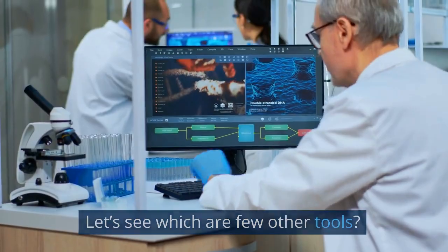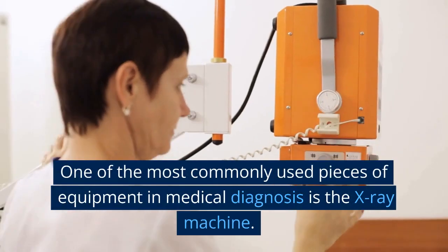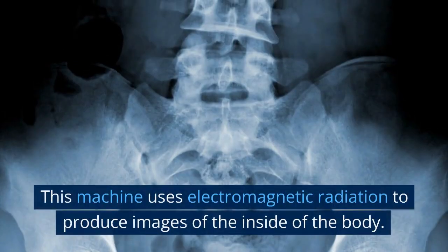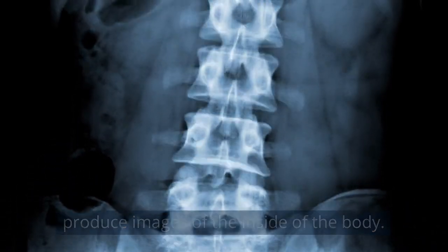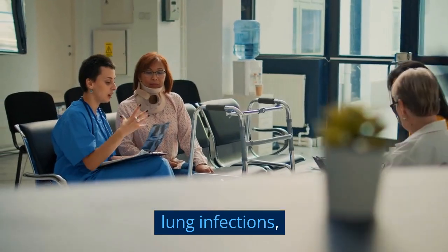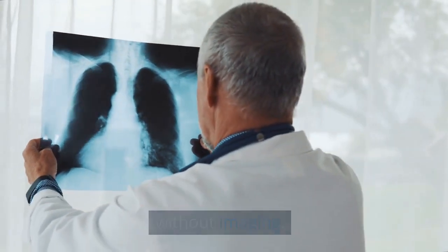Let's see a few other tools. One of the most commonly used pieces of equipment in medical diagnosis is the X-ray machine. This machine uses electromagnetic radiation to produce images of the inside of the body. X-rays are often used to diagnose bone fractures, lung infections, and other conditions that are difficult to detect without imaging.